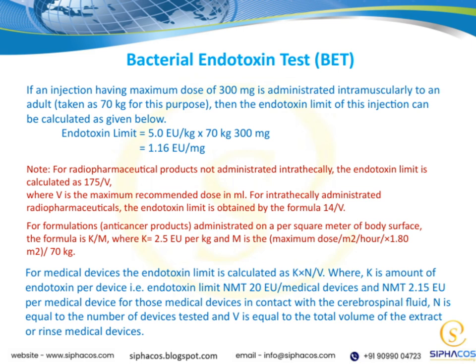Finally, let's briefly touch on the bacterial endotoxin test, or BET. This test is essential for ensuring our products are within safe endotoxin limits. It involves specific procedures to detect and quantify endotoxins, helping us maintain safety and compliance in our manufacturing processes.